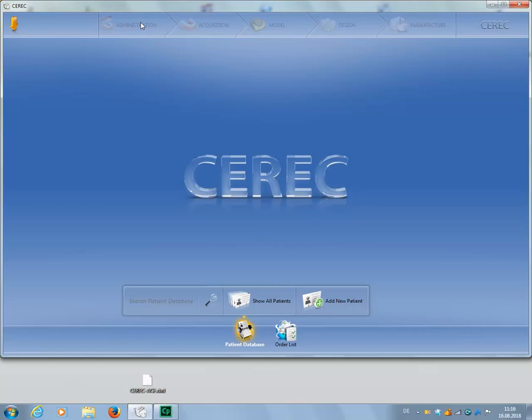Alternatively, you can first navigate to the storage location of the .dxd file, then import it into the CEREC software via drag and drop.